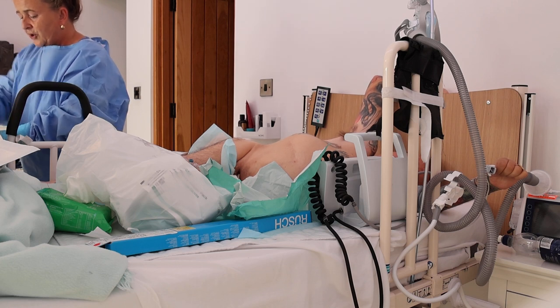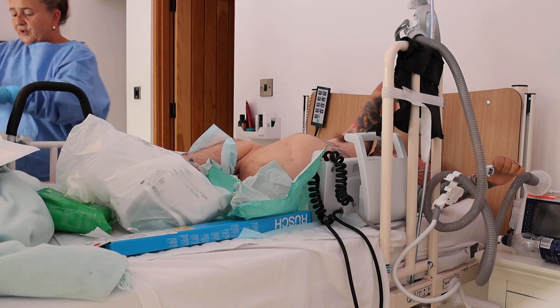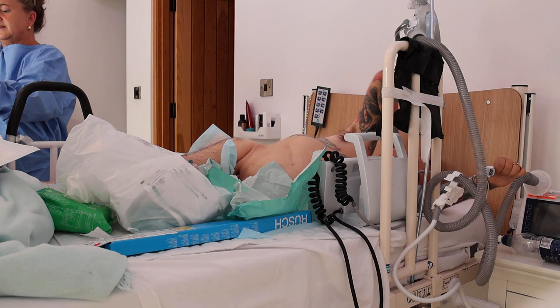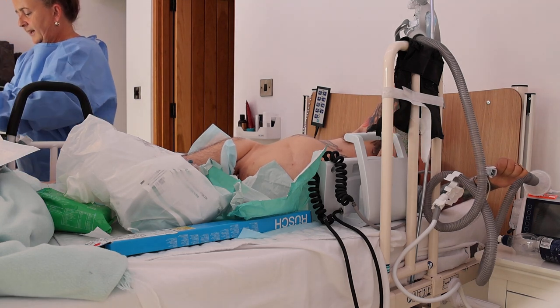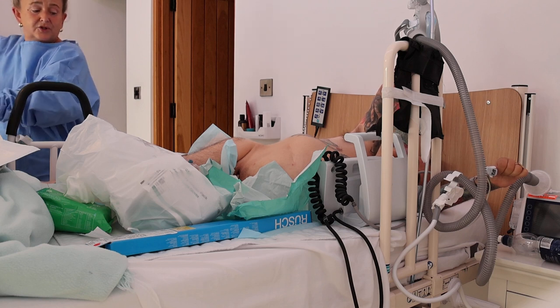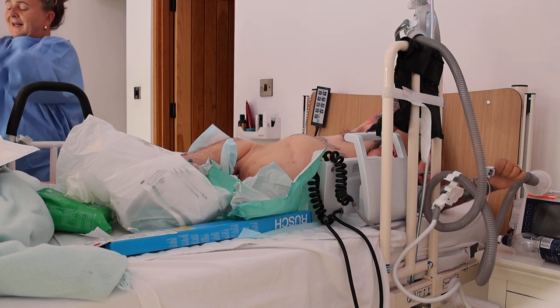Here we go, Ben. I can move that out of the way. I'm not doing a bladder wash on the basis that it's gone too far. I've done all the steps that I possibly can this week to help him, including antibiotics. And like I said, this will now go forward into getting it right, putting it back, and stopping him from urinating, and it goes back into the super-pubic. Although we've had both, haven't we, Ben? It's kind of weird, because Ben's had it both ways.